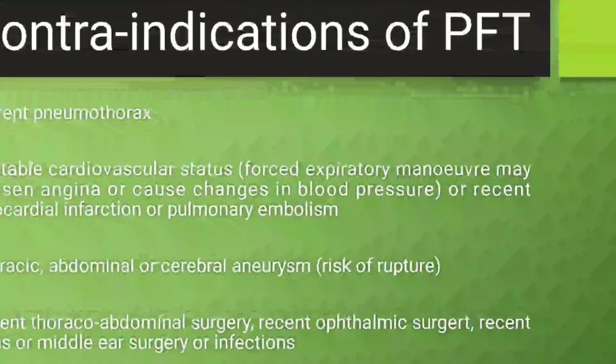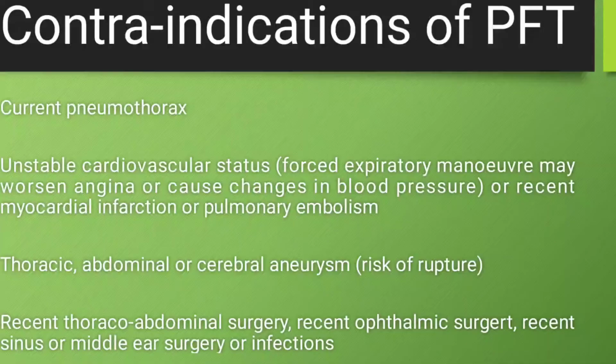Hemoptysis, current pneumothorax, or unstable cardiovascular status, because it may aggravate the angina, or recent myocardial infarction or pulmonary embolism. Thoracic, abdominal or cerebral aneurysm, because risk of rupture may be there. Recent thoracoabdominal surgery, recent ophthalmological surgery, recent sinus or middle ear surgery or infections can be contraindications.